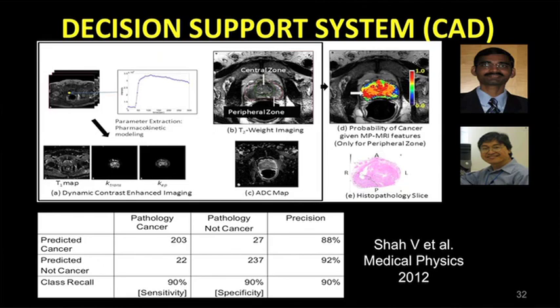And recently, we put 26 images to a government website through which anybody in the world can access. And we put these multiparametric MRIs with the whole histopathology live. So anybody who is interested in image processing, in developing CAD systems, in developing segmentation algorithms, or anything else that they want to work on, they can access this website, they can download these images, they can play with these images, publish, and they can come up with a solution. We just want the solution.